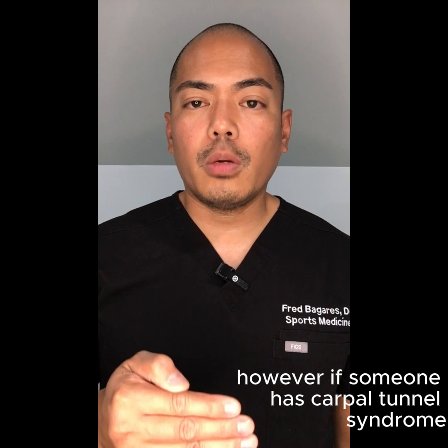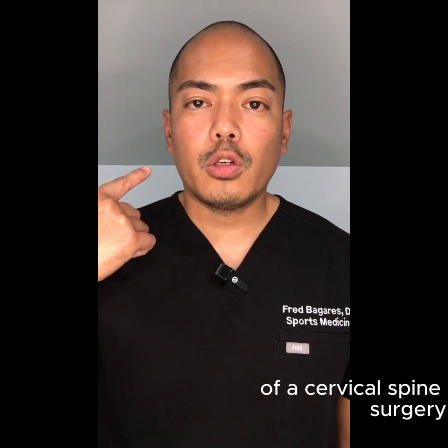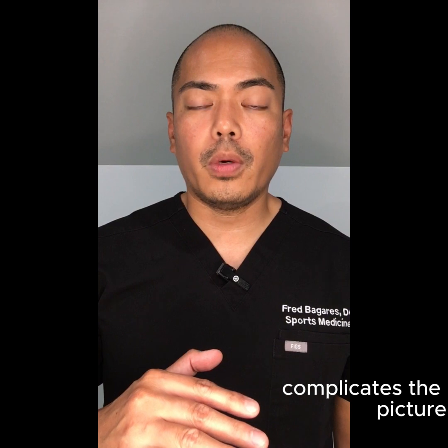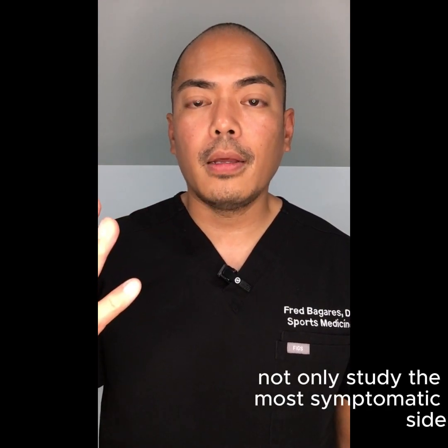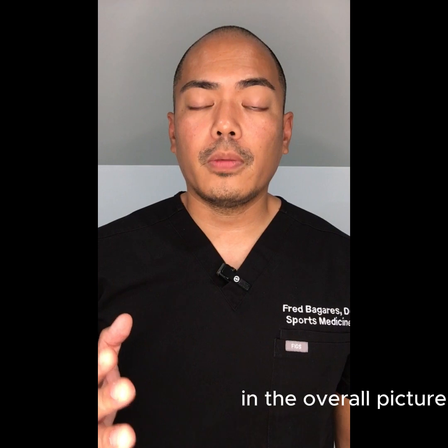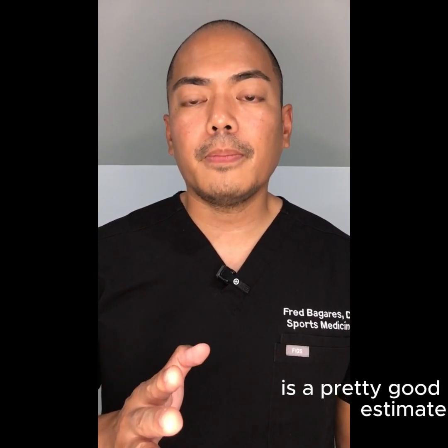However, if someone has carpal tunnel syndrome, a history of a cervical spine surgery, in addition to underlying diabetic neuropathy, sometimes that complicates the picture, where I have to not only study the most symptomatic side, but I might have to involve one of the other limbs to give context to what I'm seeing in the overall picture. So 30 to 60 minutes is a pretty good estimate.